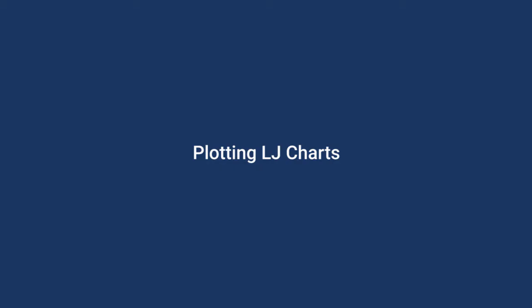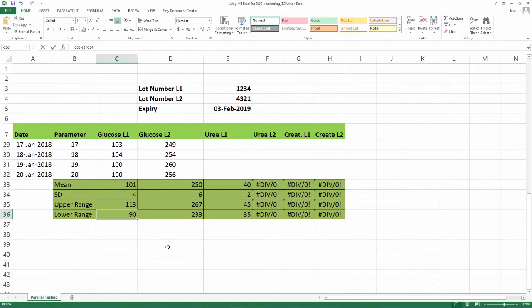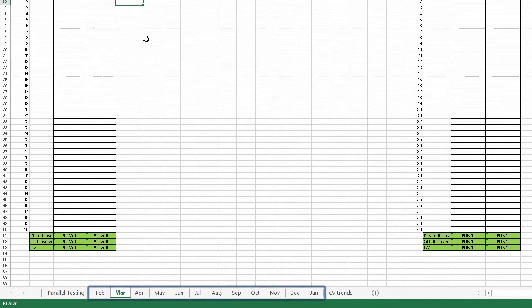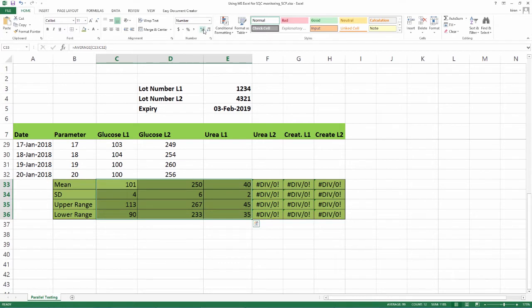Plotting LJ Charts. Now that we have obtained the required values to plot the chart, let us proceed with plotting. It is convenient to use one sheet for each month and also plot the different levels near to each other to monitor within run outliers. Please go through the earlier videos to understand the concepts. But before we do that, let us look at these numbers once again.